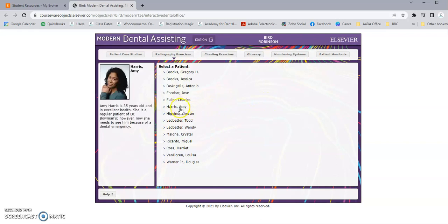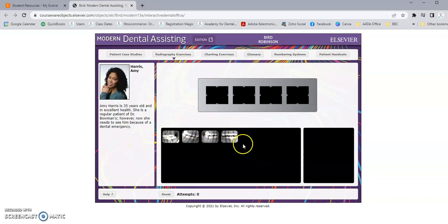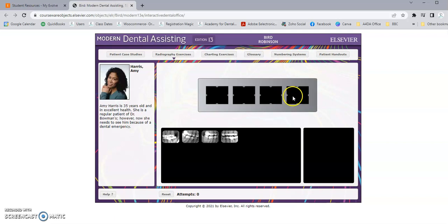As an example today, I'm going to click Amy Harris. These are bite wings — these are the x-rays that are taken, and this is the mount at the top. When you take x-rays traditionally in digital software, it will already put them in the correct place for you in the mount. But if you accidentally took a PA of, say, number 31 when it was supposed to be 18, you can easily move it. So these are bite wing x-rays and we're going to mount them.